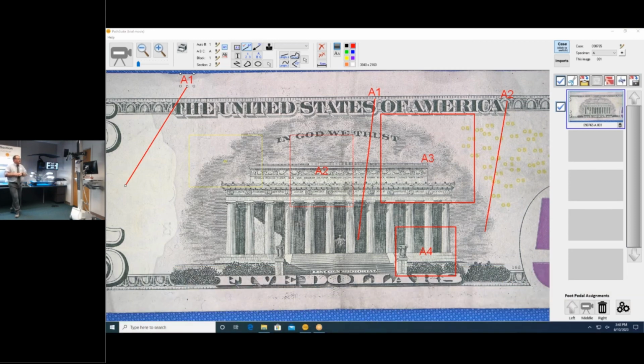Other things, let's talk about computers a little bit. Generally we like to provide you with a specification for your computer so that your IT department can own the computer, because they're going to want to put their own image on it, the LIS, dictation software, all that stuff. We can provide screens as part of the quote because we like to pick really good screens. But the computer, we can give you the specs and have your team buy and maintain the computers.